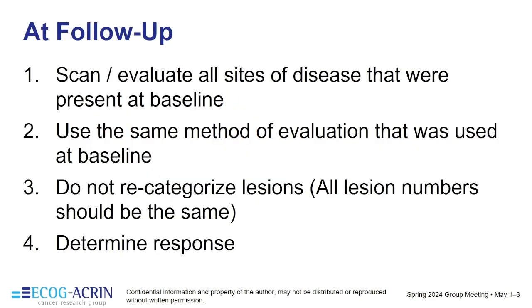So once we complete baseline, we then have our follow-up. Once again, it's important to scan/evaluate all sites of disease that were present at baseline. It's important to use the same method of evaluation that was used at baseline. This is a protocol requirement. If you change the method of evaluation, it will be considered a deviation.